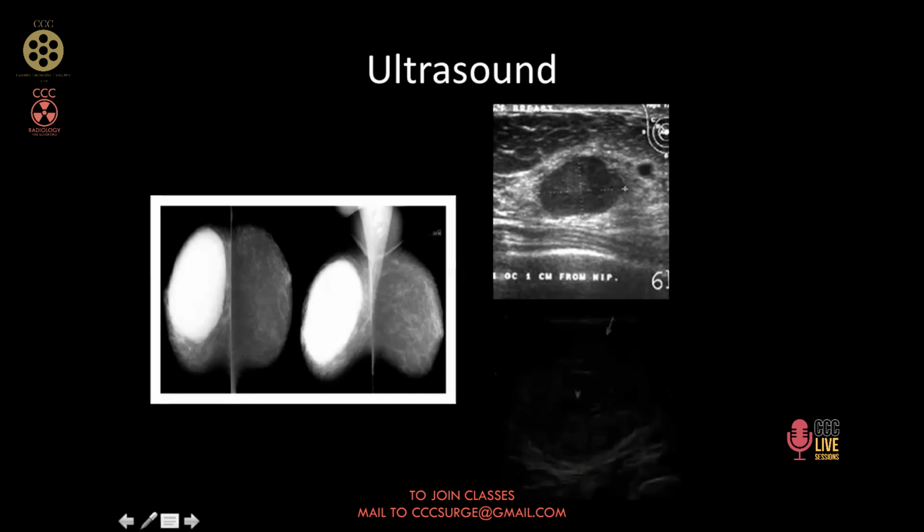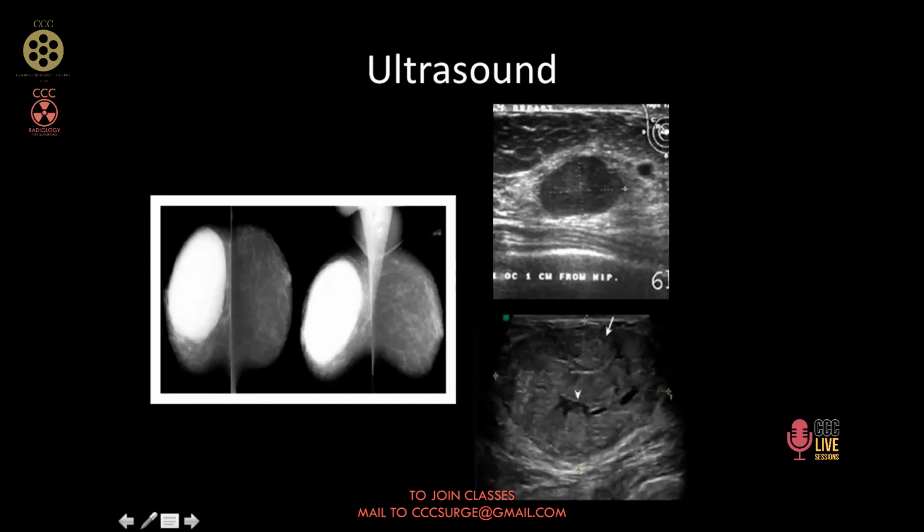Now I give you the third picture. Now look at this picture. This is also a benign lesion because there is a perilesional halo. The transverse diameter is more than the anteroposterior diameter. But what is the difference between this one and this one? Mammographically, both will look the same. The important feature is the clefts in between.